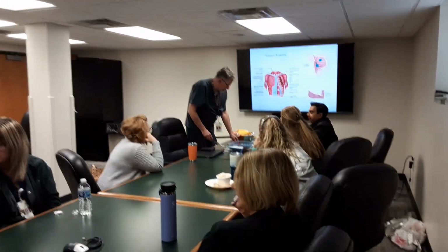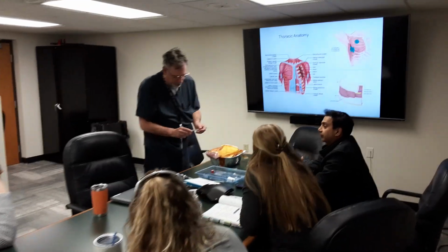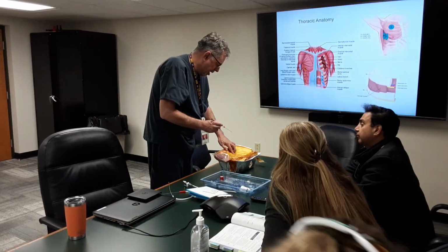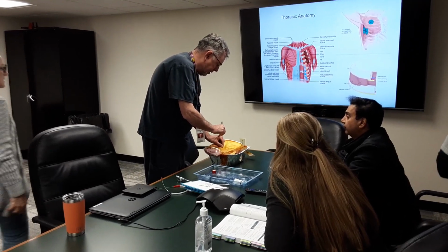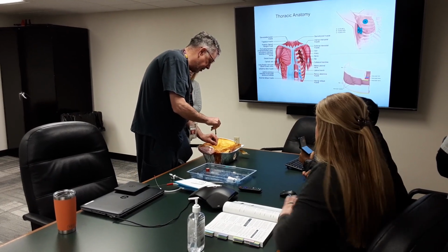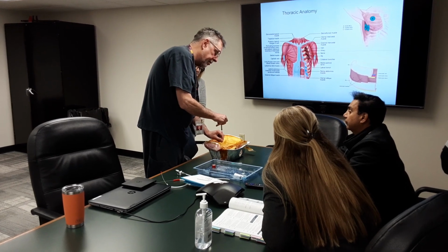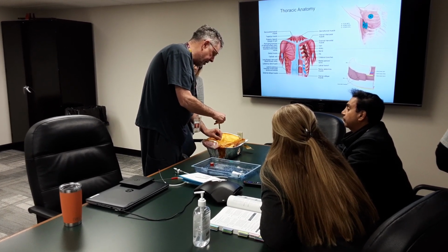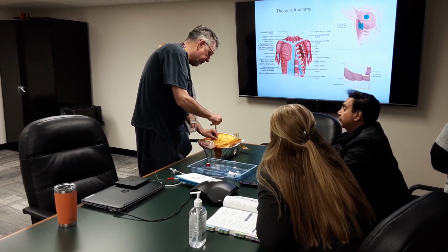Now we're gonna take this, bring them, and pretend we're in the anterior chest. Set this up so that the bevel's up, with the numbers. We're gonna walk in here. Feel, and what we're gonna do is, I don't have any liquid in it, so I can't pull back, right, because I'm not through yet. Pull it back, pull it back, pull it back. Alright, there we go.